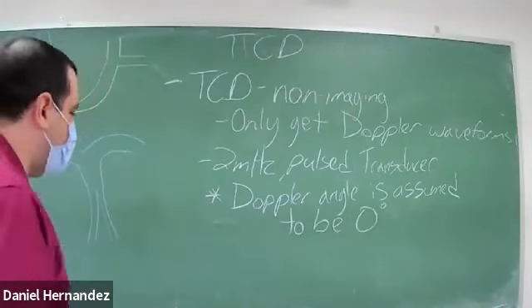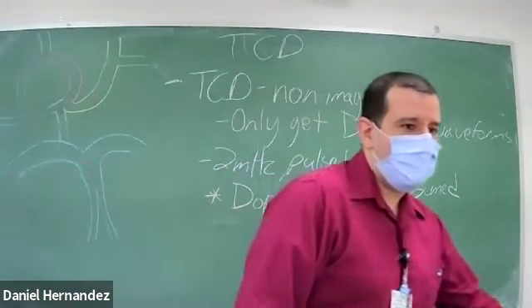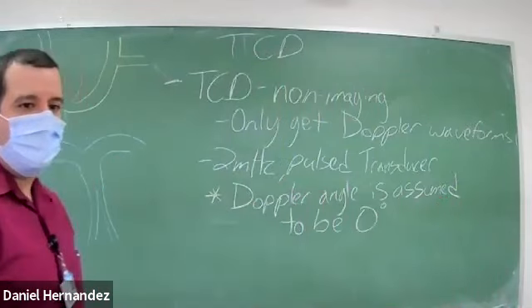But as technology advanced, we are now able to do transcranial color-coded duplex sonography.